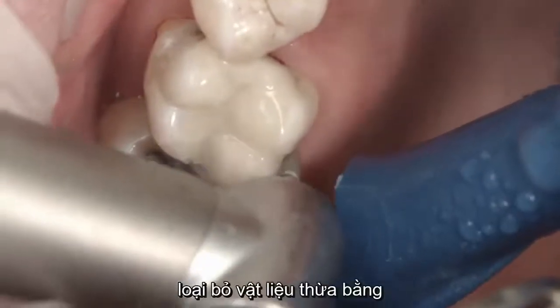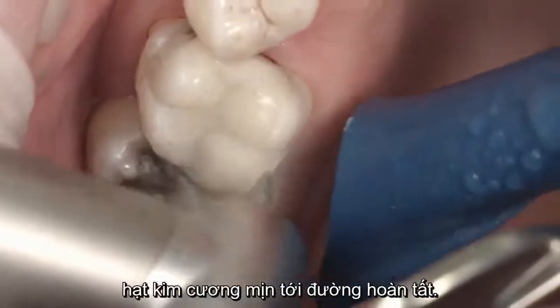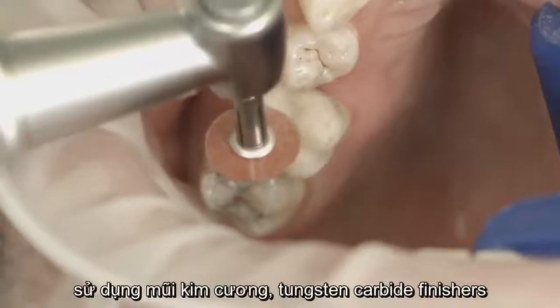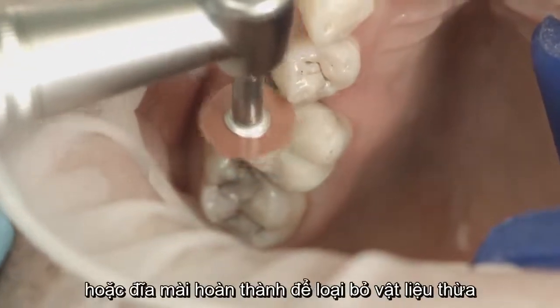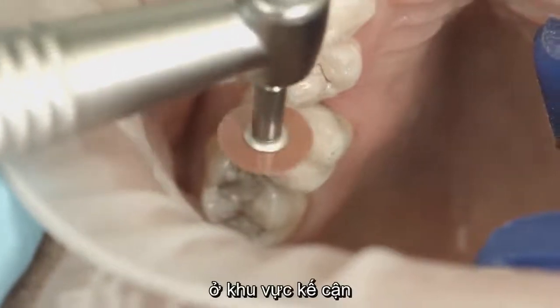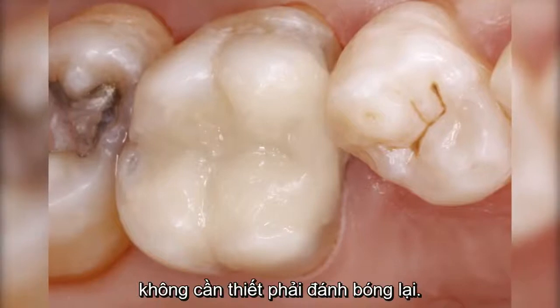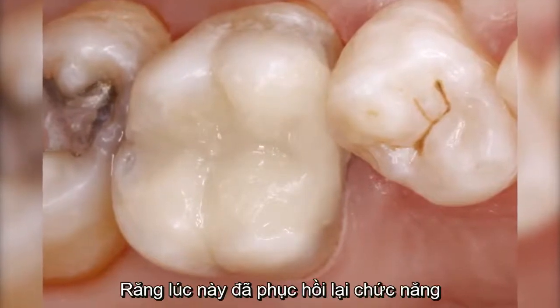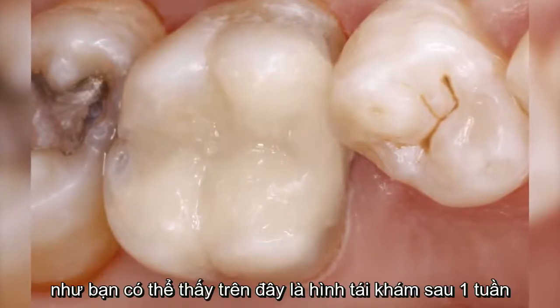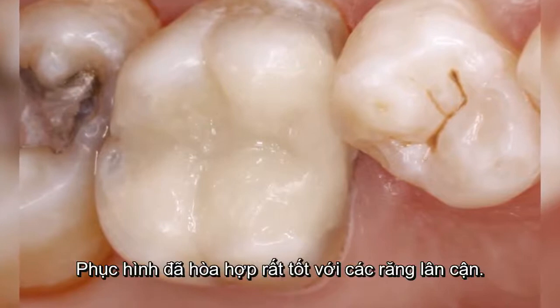Remove excess material using suitable tungsten carbide burrs or fine-grained diamonds and adapt the margins. Use diamonds, tungsten carbide finishers or flexible finishing discs to remove excess in the proximal area. High-gloss polishing is not necessary. The tooth is now restored to its function and tooth-colored appearance. As can be seen at the recall after one week, the restoration blends in well with the rest of the dentition.